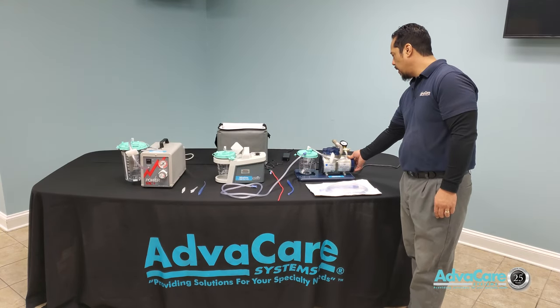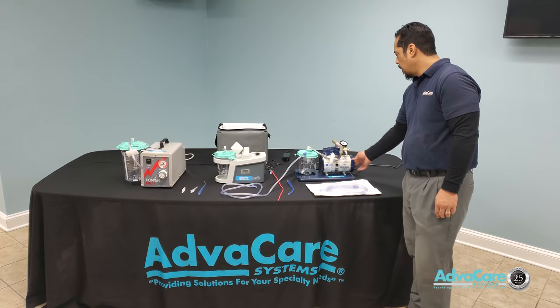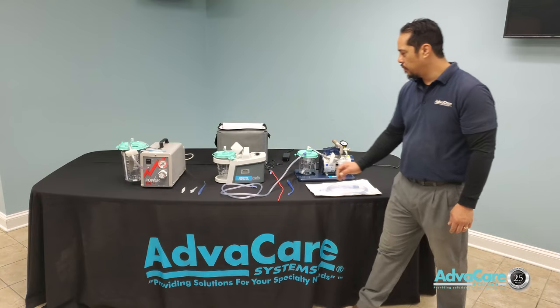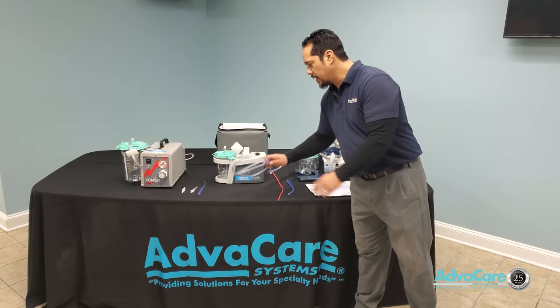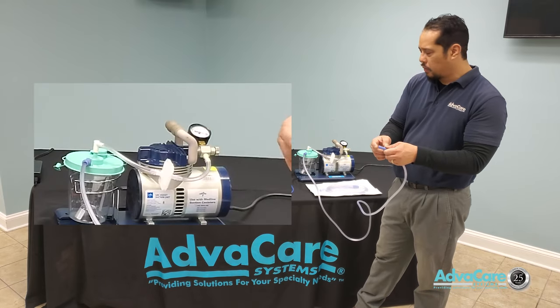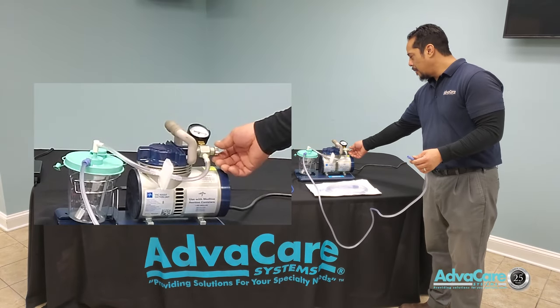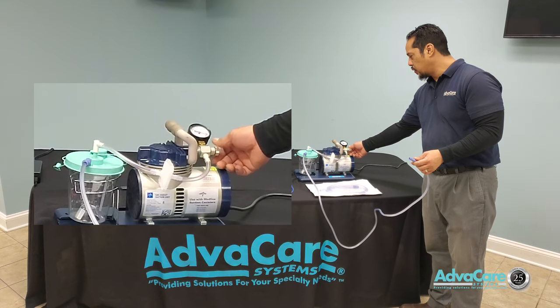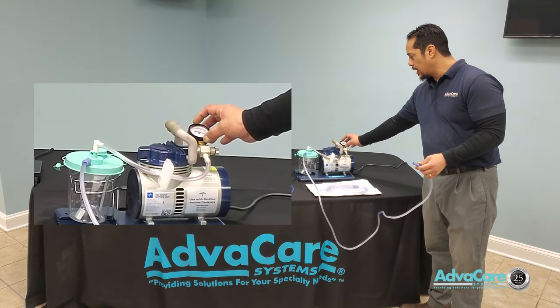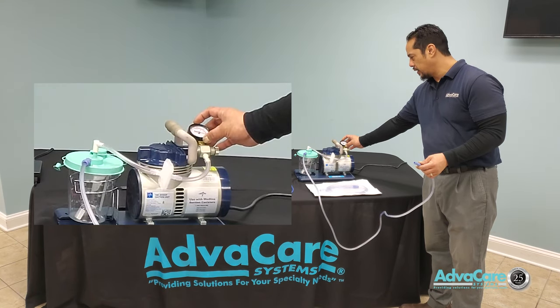In order to adjust pressure, you would have to turn on the machine. Once your machine is operable, if your tubing is connected and there is free air flowing through, any adjustments made to the pressure control knob will not have a great direct impact on how the pressure increases or decreases.